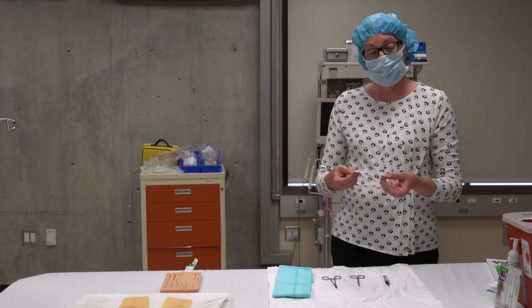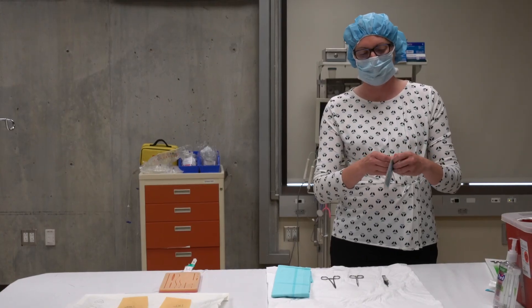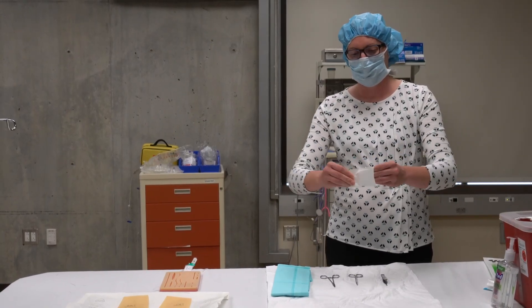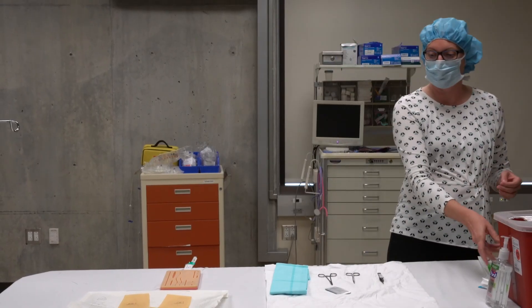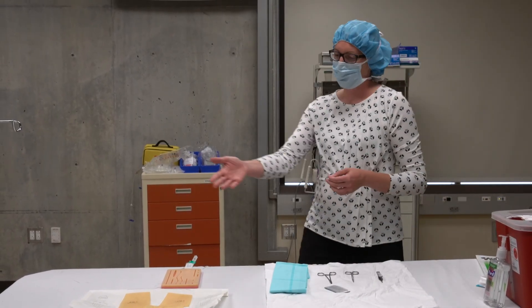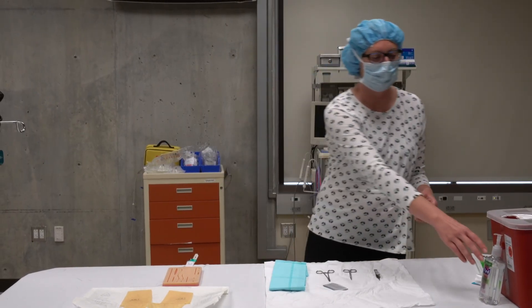For this demonstration we're going to use silk suture. With my dirty hands I'm going to open the suture onto the sterile field. The suture in its package is sterile and I'm only going to touch it with my sterile gloves. Now I've opened my suture, opened my gloves, and have the instruments I need on my sterile field. I'm going to wash my hands.